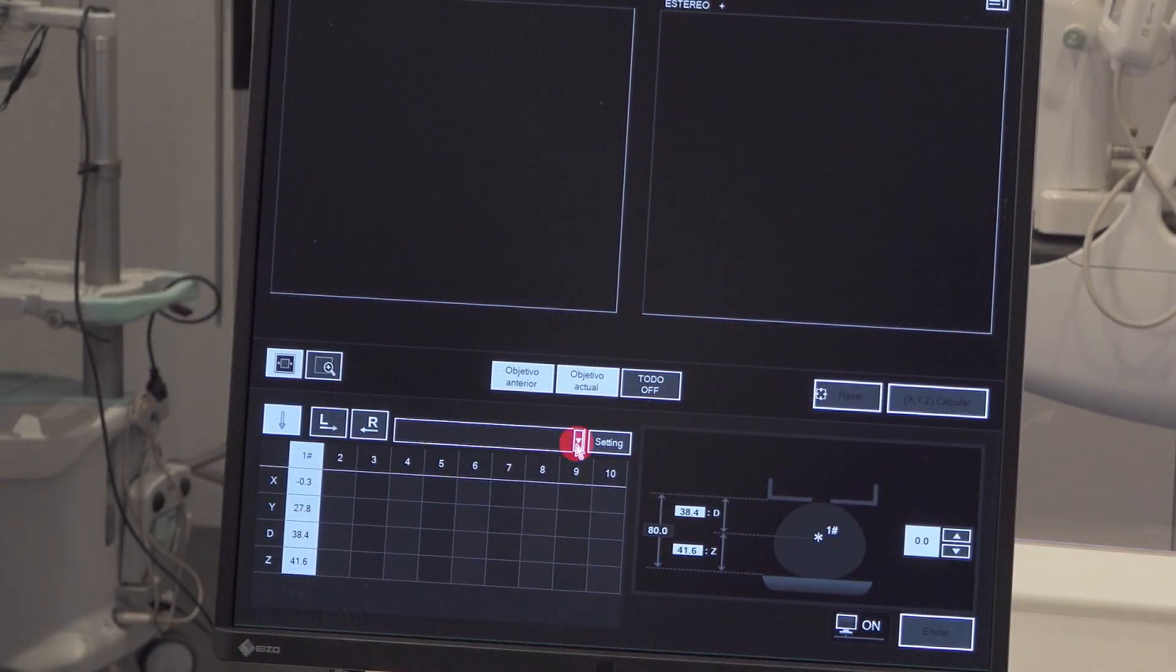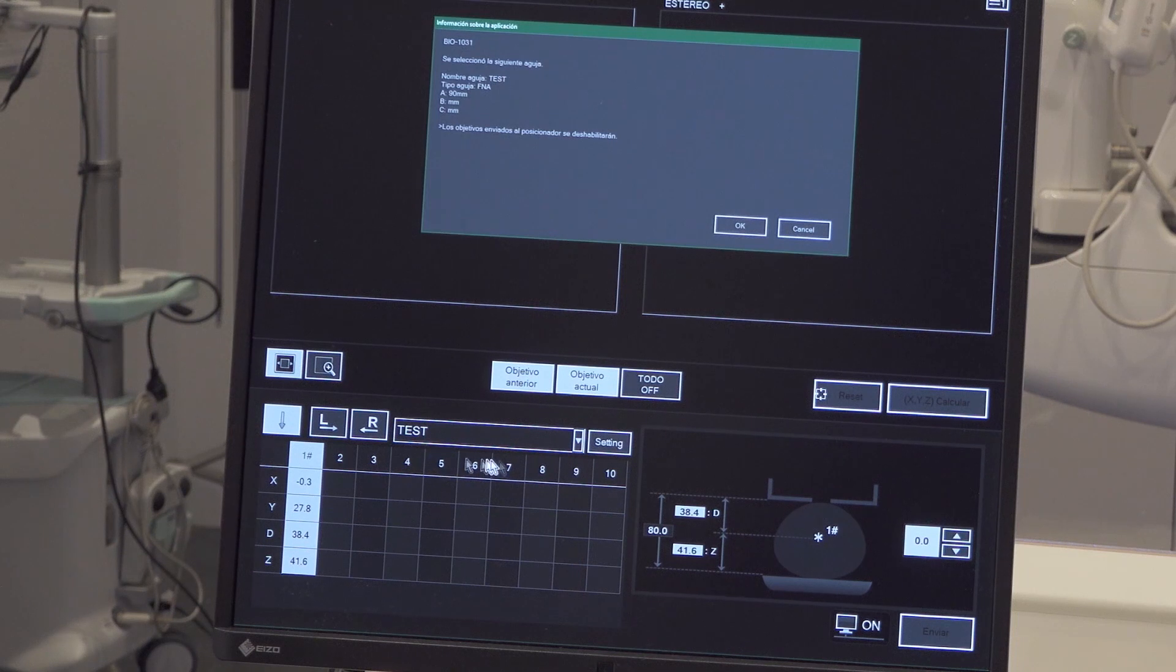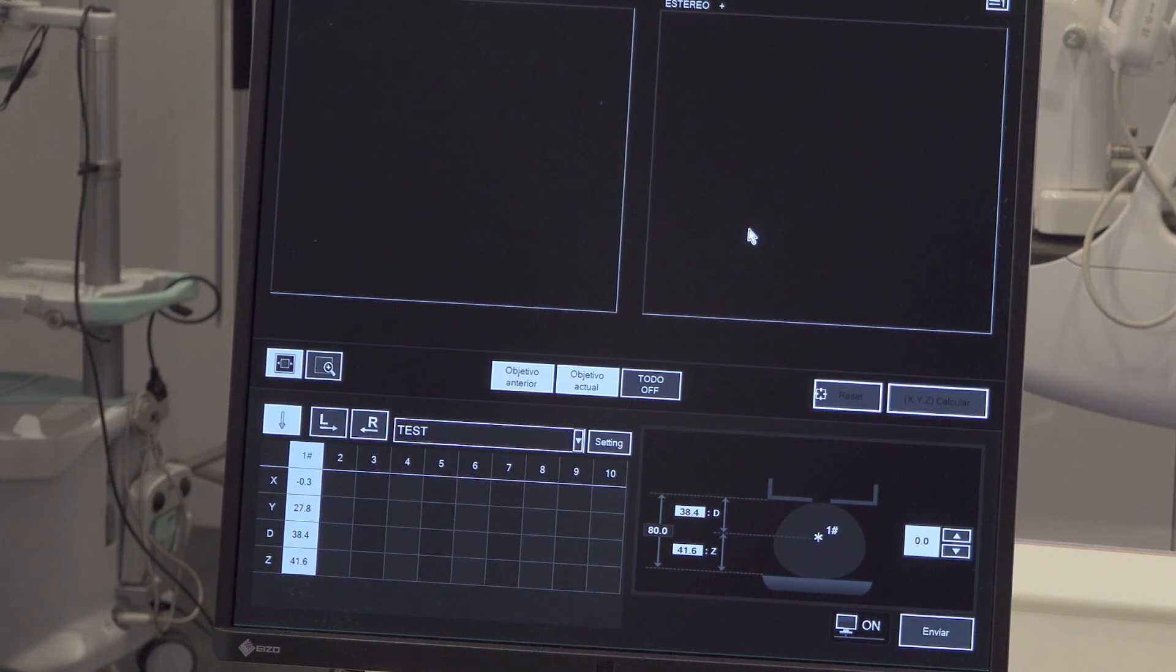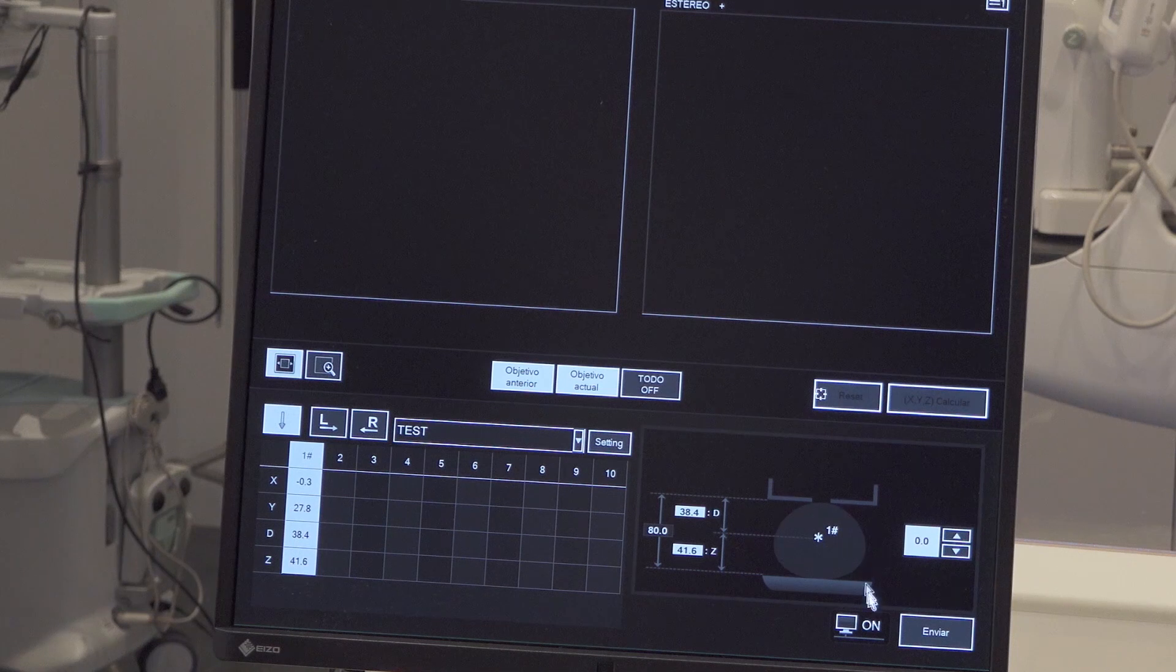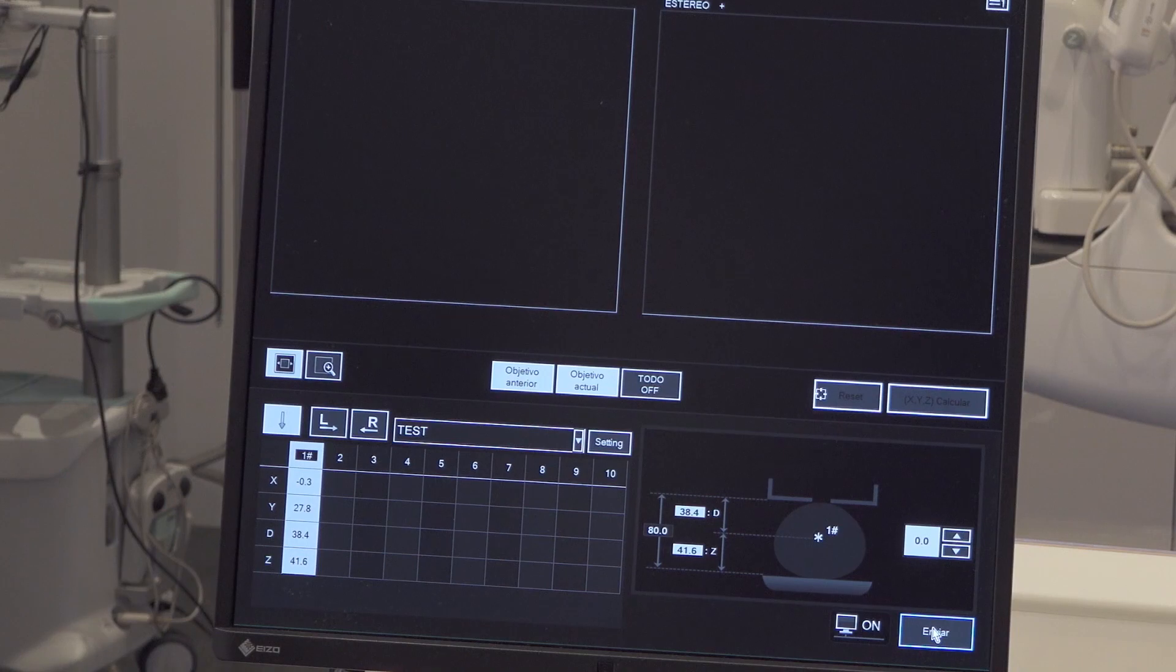Open the needle drop-down menu and select the test calibration needle. Confirm selected needle values. Click the Send button to send coordinates and needle characteristics to the biopsy positioner.